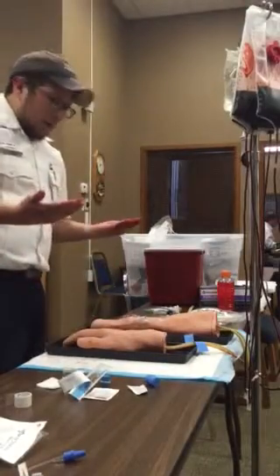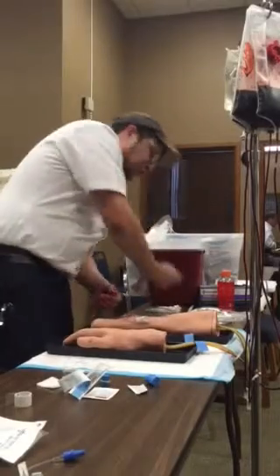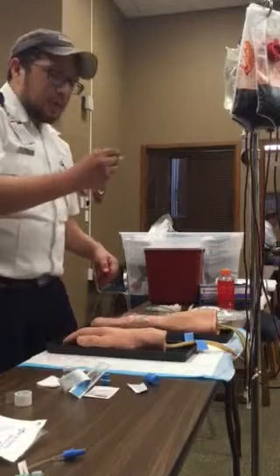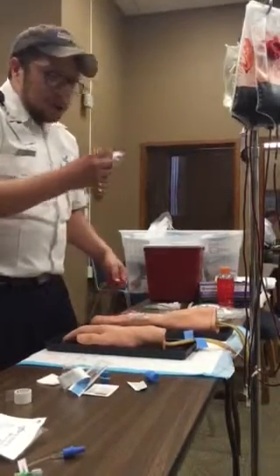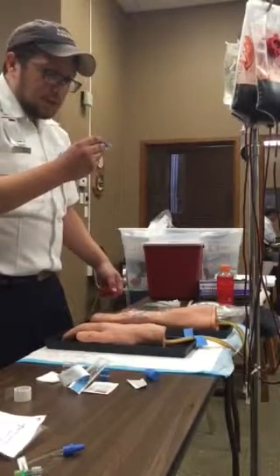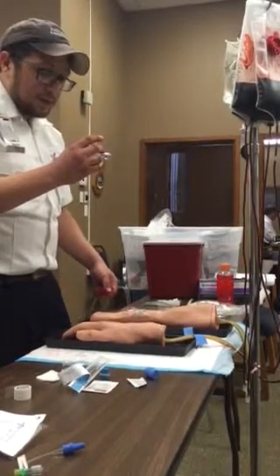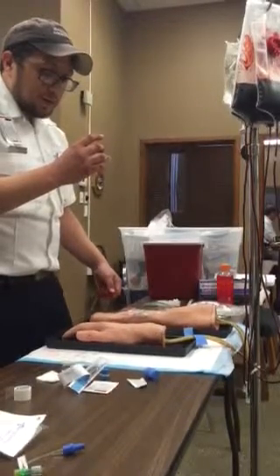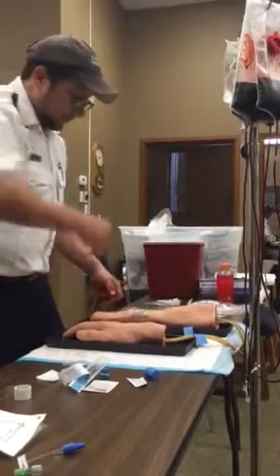Okay, I'm going to have my BSI on still here. I'm going to go ahead and give my patient atropine. I'm going to look at the atropine and make sure it's the right concentration, right dosage, right amount there, and make sure it's not expired. What is your concentration? Concentration of atropine is... well, we're going to give 0.5 milligrams of atropine.